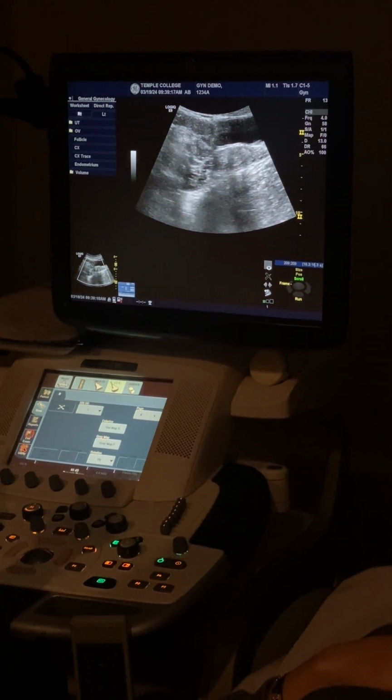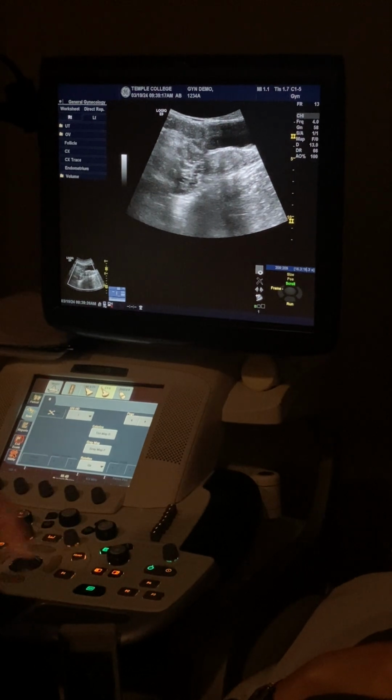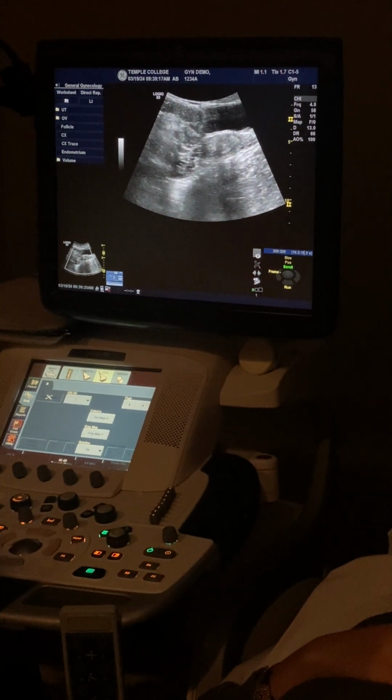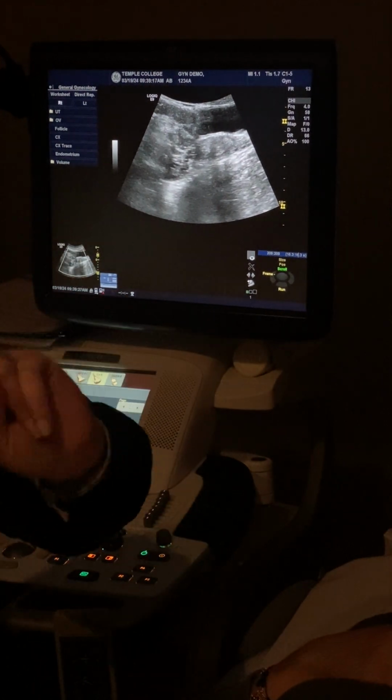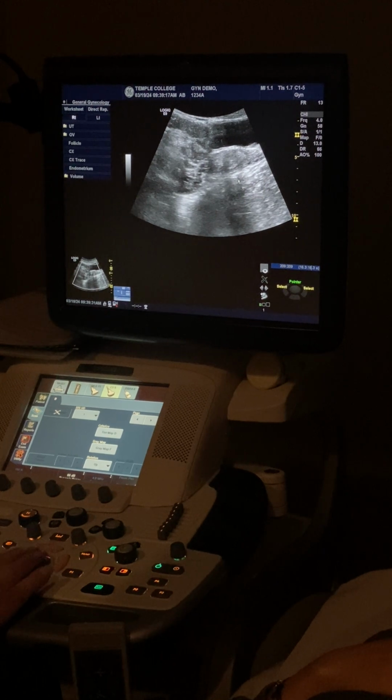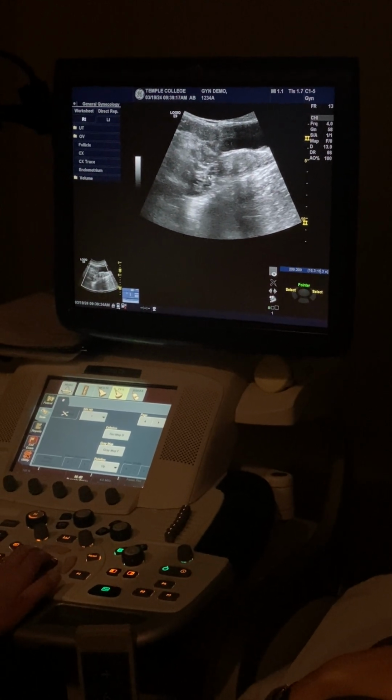But you guys see the ovary? Yes. Everybody see it? Who does not see it? No shame if you don't see it. Ovaries are hard. Ovaries are hella hard, just so y'all know. Can you point out the tubing? Can you see it? Somewhat. Right here. Okay, that's why I was wondering if I was looking at that.